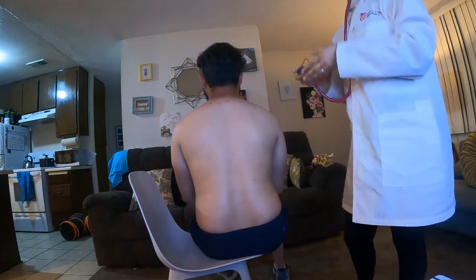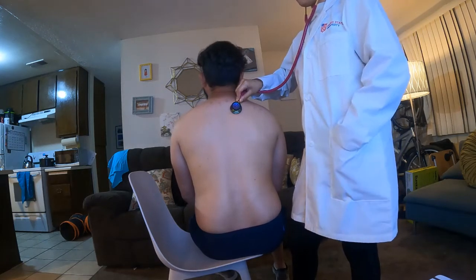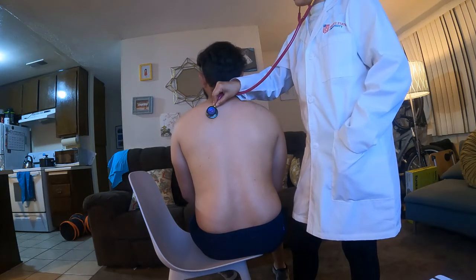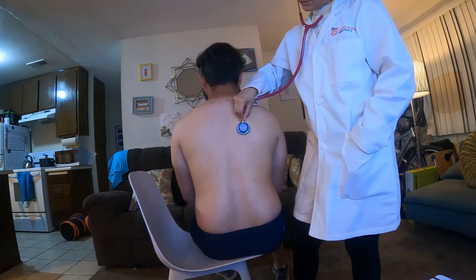Now I can perform auscultation in the back. Nice deep breath in, let it out. And once again. And then I compare it side to side.